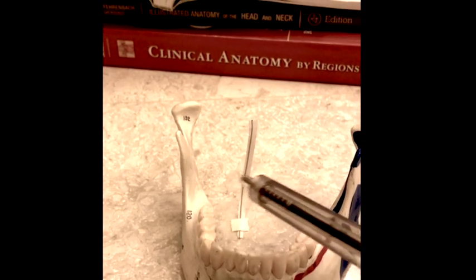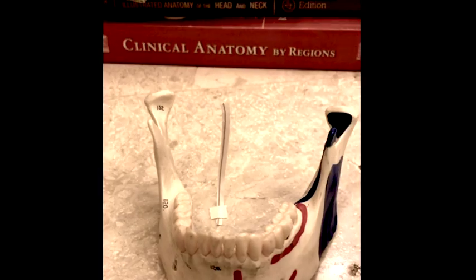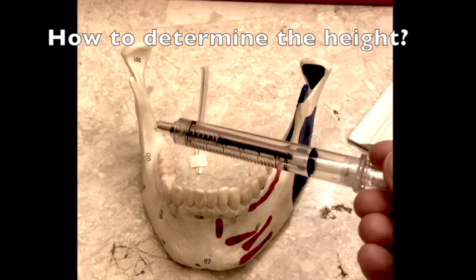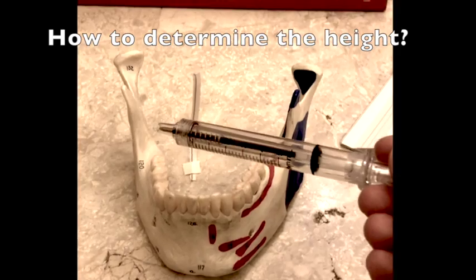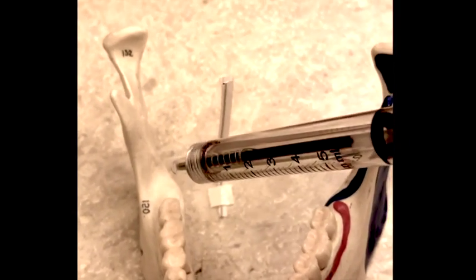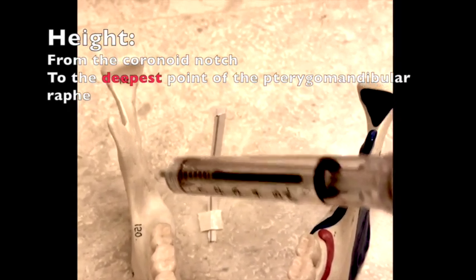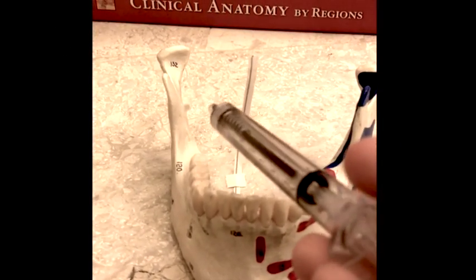To determine the correct height using anatomical landmarks: the correct height is six to ten millimeters above the occlusal plane. Another technique is to follow the anatomical structure of the coronoid notch — that depression here — and draw an imaginary horizontal line from the coronoid notch to the pterygomandibular raphe.